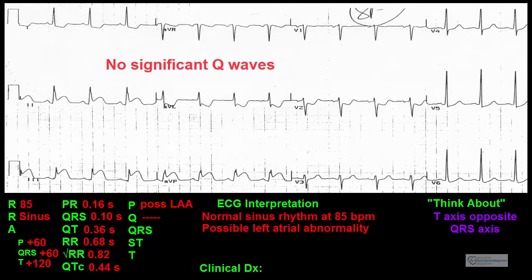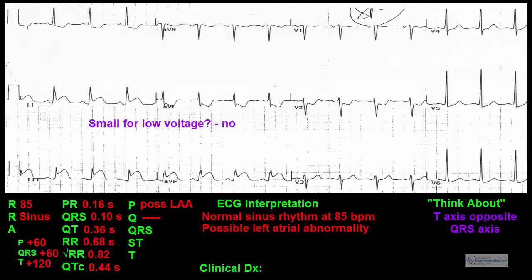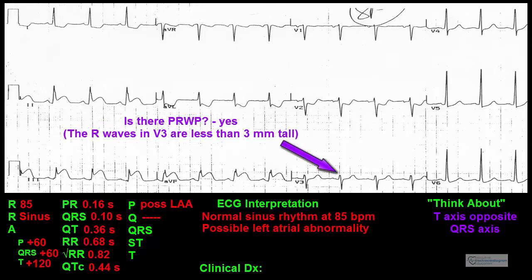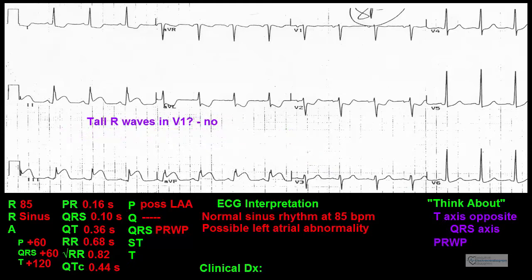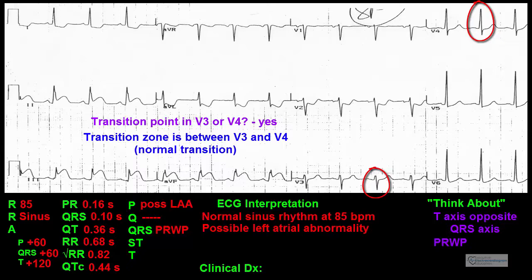Q waves: There are no significant Q waves seen. QRS complexes — let's ask the six questions. Are they tall, suggesting left ventricular hypertrophy? No. Are they small, suggesting low voltage? No. Are they wide, suggesting a bundle branch block? No. Are the R waves in V3 less than 3 mm, suggesting poor R wave progression? Yes — this will be noted in the think-about section. Are there tall R waves in lead V1? No. Is the transition point in lead V3 or V4? Yes — it is between V3 and V4, which is normal transition.